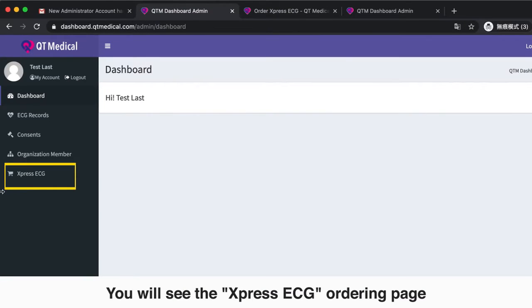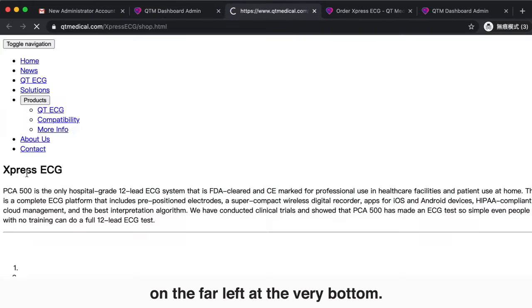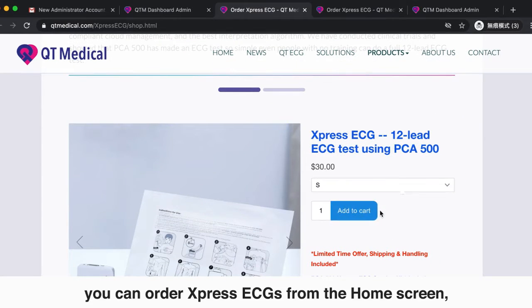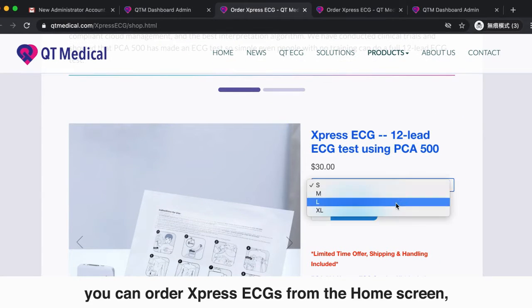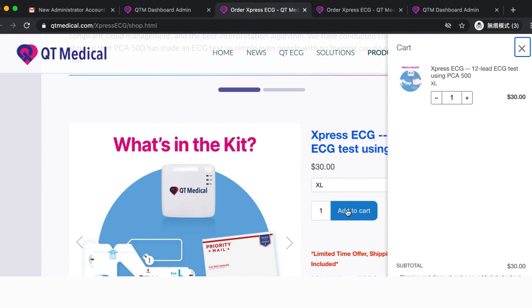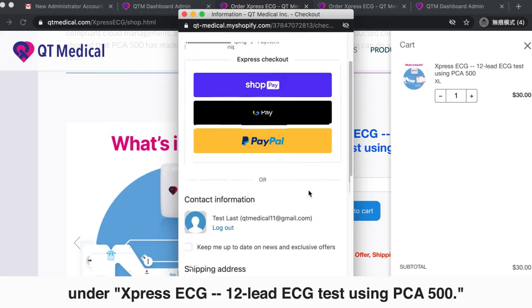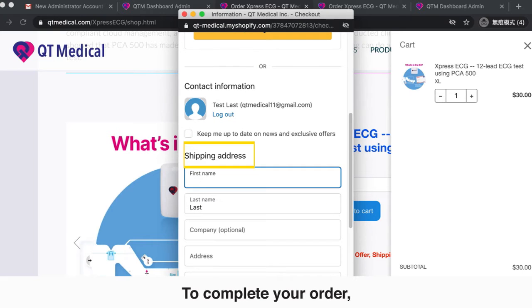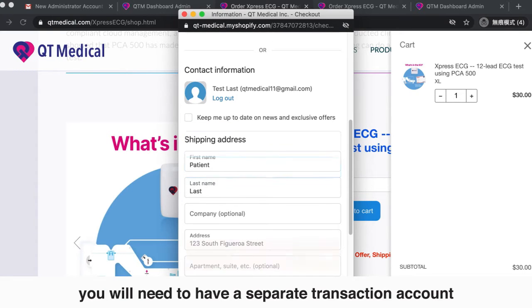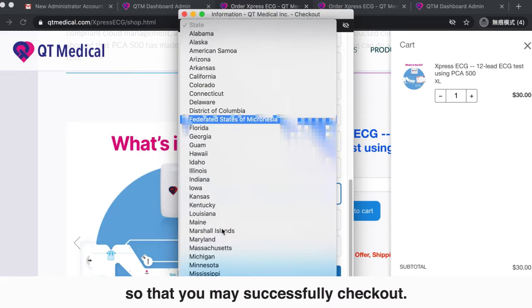You will see the Express ECG ordering page on the far left at the very bottom. Now that you have successfully enrolled, you can order Express ECGs from the home screen simply by tapping Add to Cart under Express ECG 12-Lead ECG Test using PCA500. To complete your order, you will need to have a separate transaction account so that you may successfully check out.